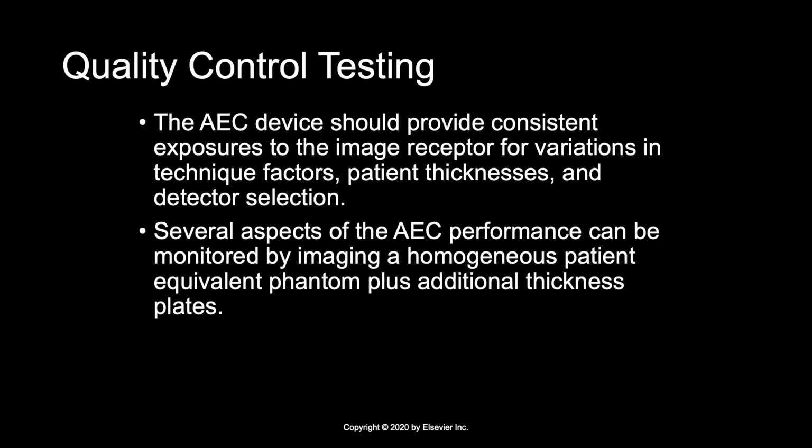The RT must use AEC accurately, regardless of the type of IR used, and failure to do so can result in overexposure of the patient to ionizing radiation or a production of an image that is of poor quality. The response of the AEC device when changing the exposure variables and their effect on exposure time and brightness in the area of interest are shown in Table 13.1 of your book. So make sure and look at that chart there.